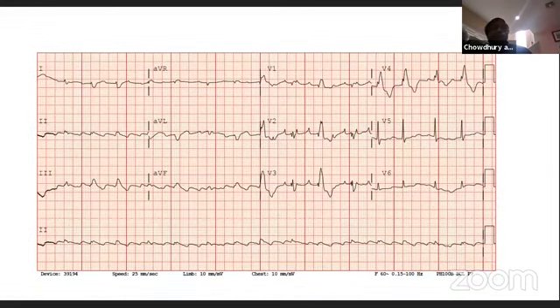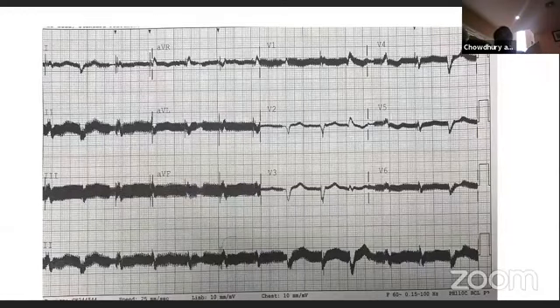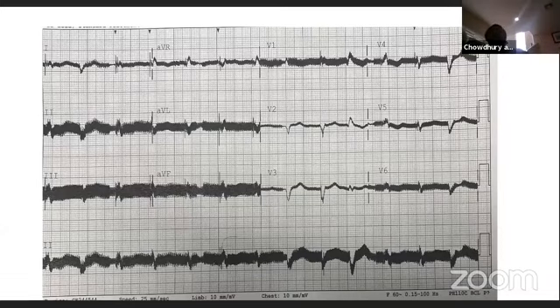And then this one, I show you. This, and I'll finish after this one. Hafiz, how big was the effusion? It was not that big. It was about 800 cc. Okay. So one of the things is that if you look at the ECG, that's only low voltage. There is no alternans. I mean, there is some correlation, right? If the fluid is bigger, you get the alternans more. Is that true, Hafiz? Yes, it is true. And then total alternans, you get even bigger.